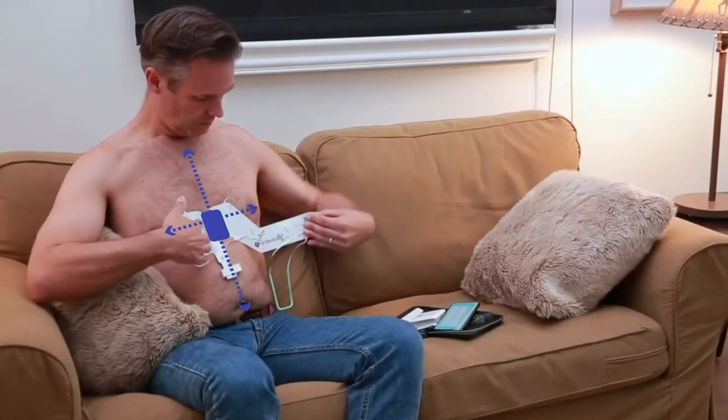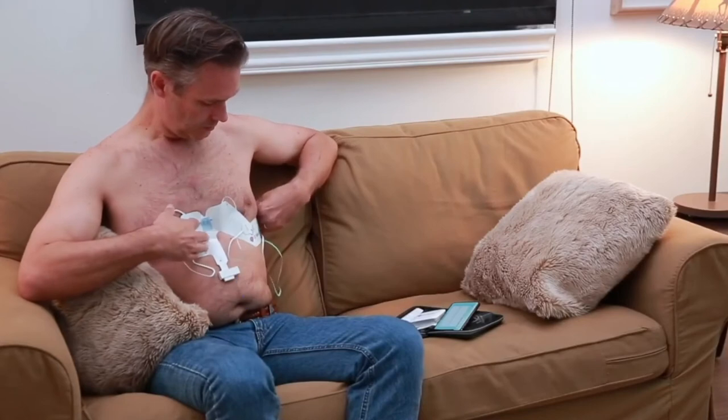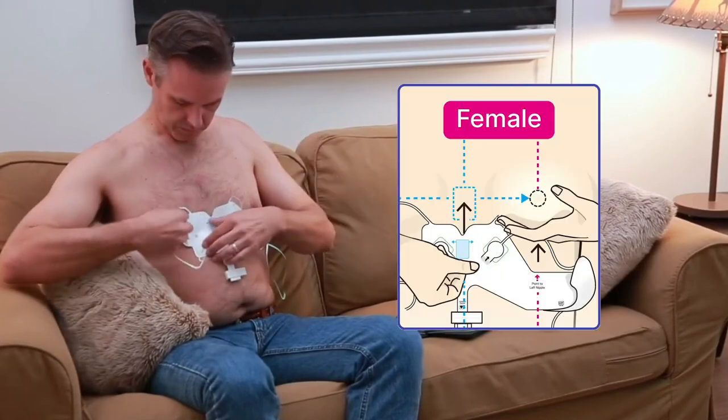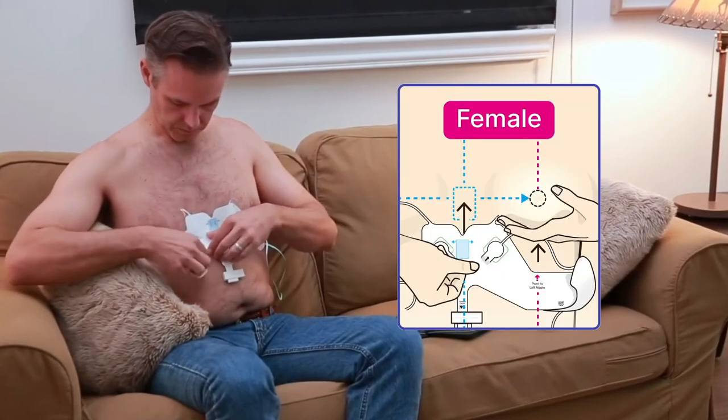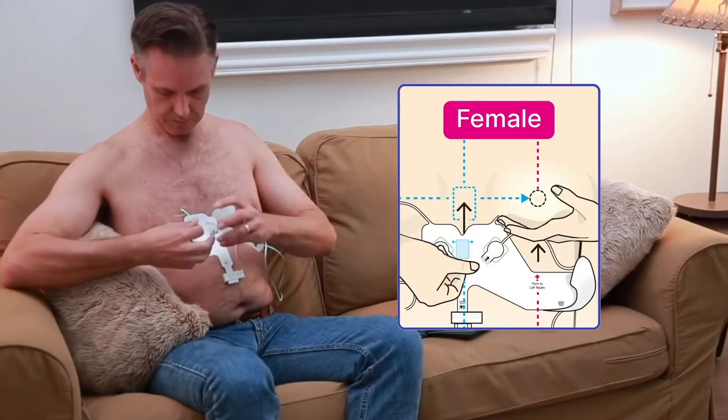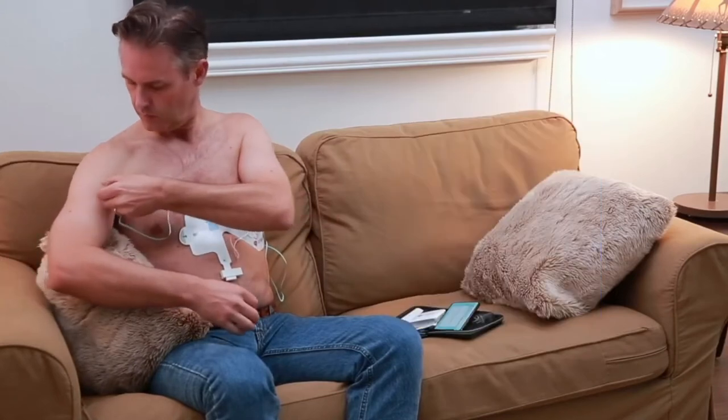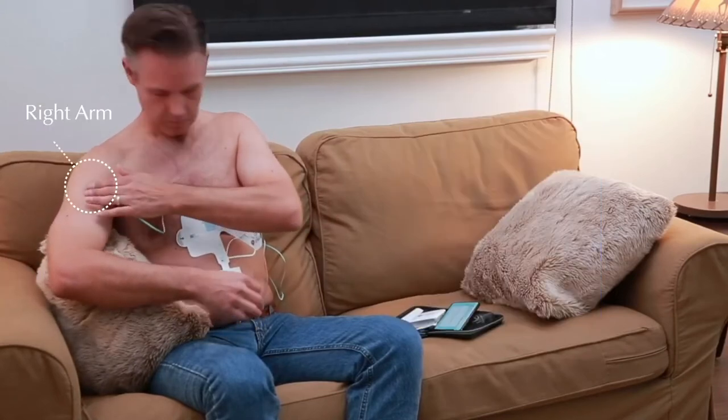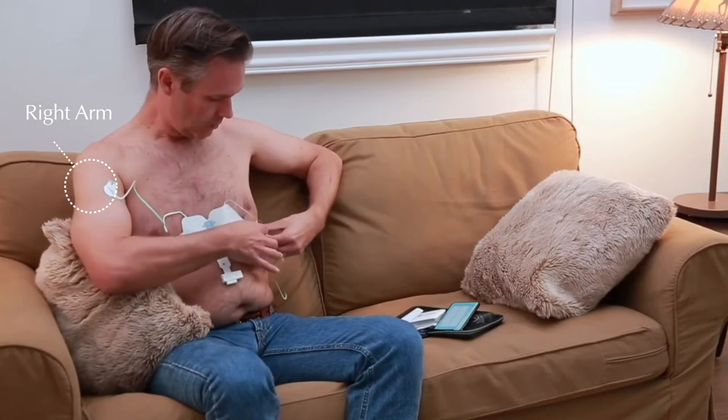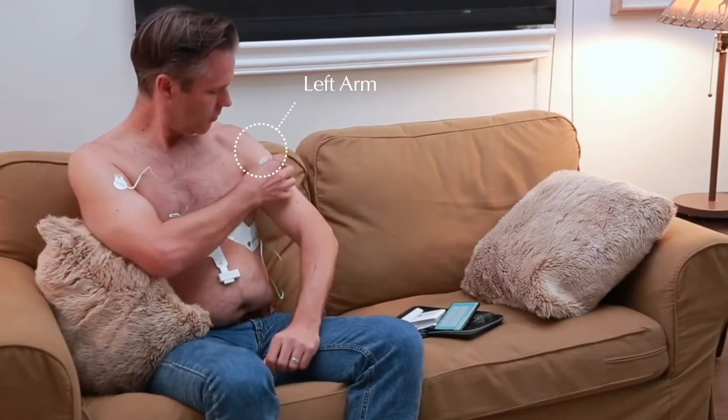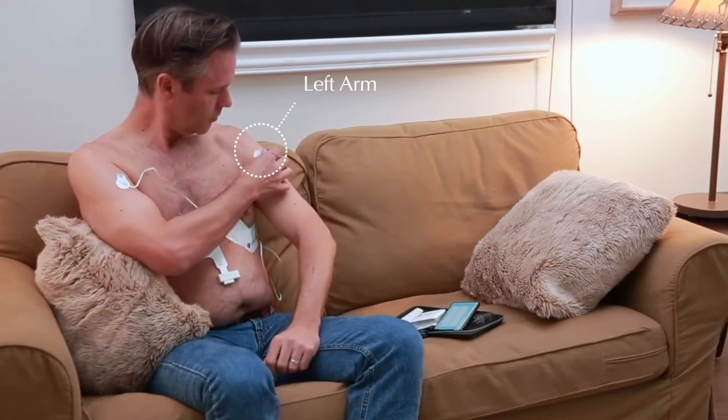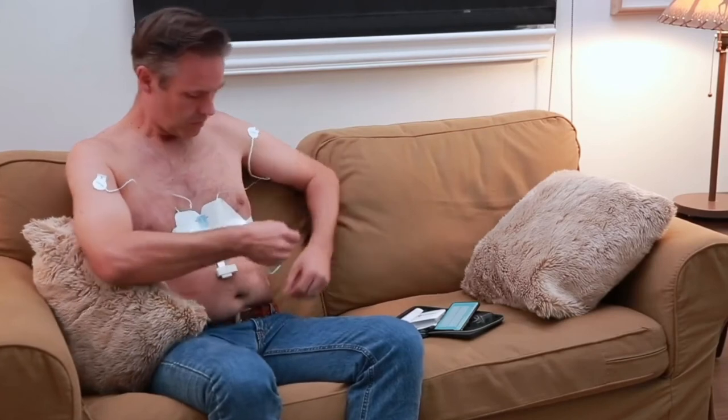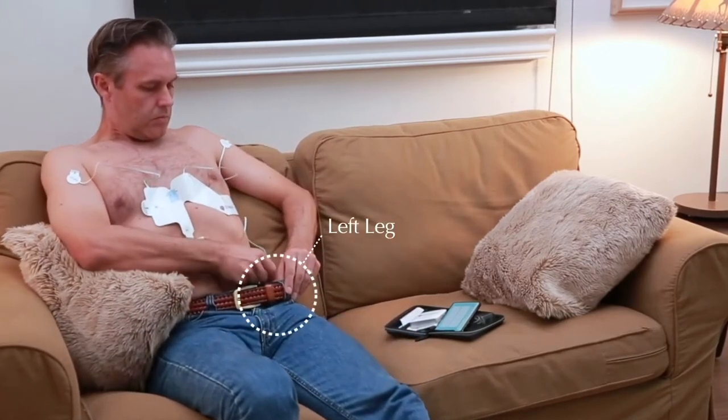Then wrap the strip around the left side of the chest. For women, the strip should wrap around the underside of the left breast. Pull the lead marked right arm and stick to the right arm, the lead marked left arm to the left arm, and the lead marked left leg to the lower left abdomen or upper thigh.